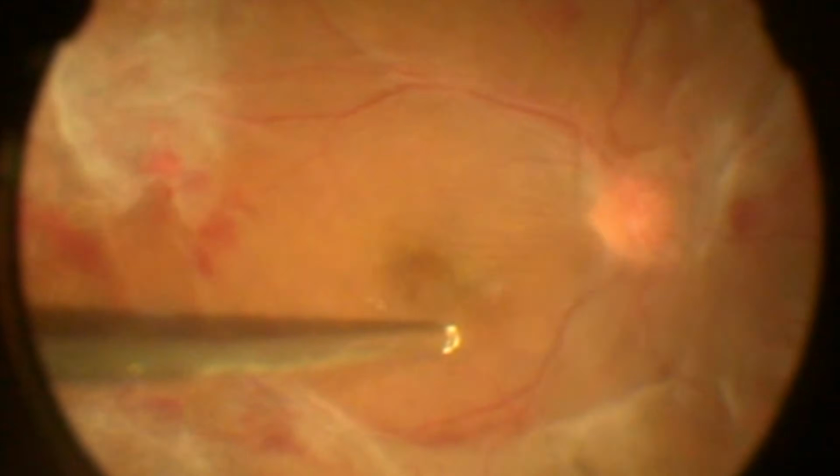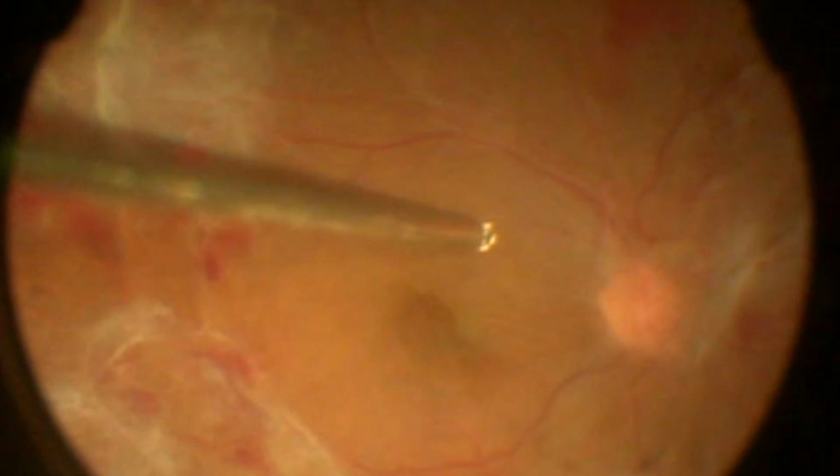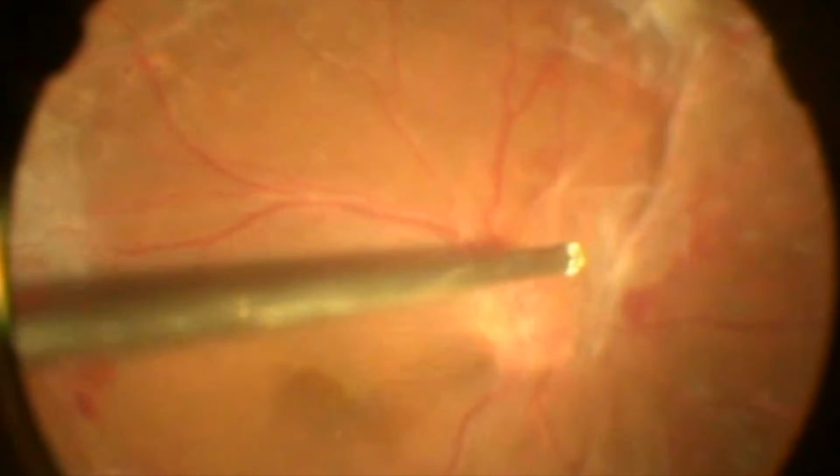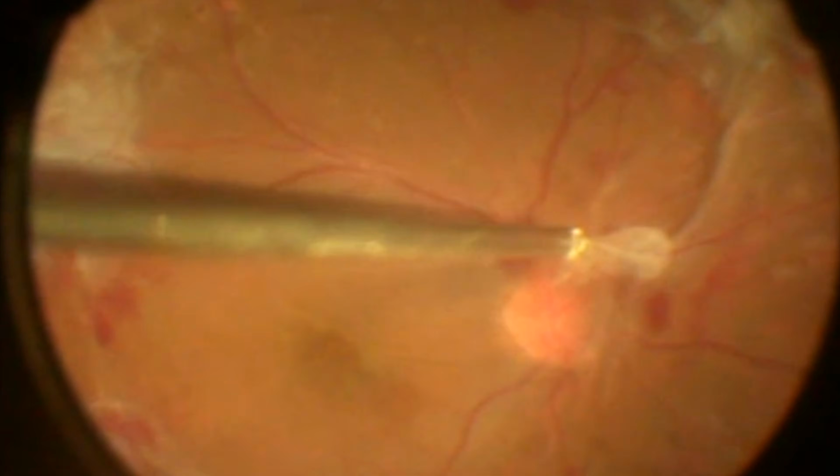It is important to carefully circumscribe the macular area, as abrupt aspiration of the posterior hyaloid may lead to the iatrogenic creation of a macular hole. Next, segmentation of the juxtapapillary traction areas is performed.